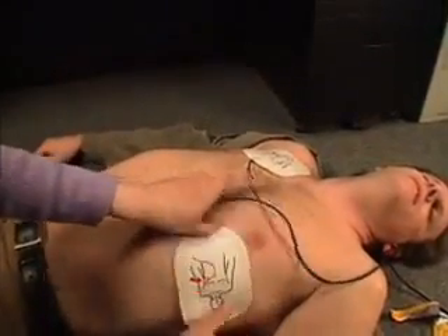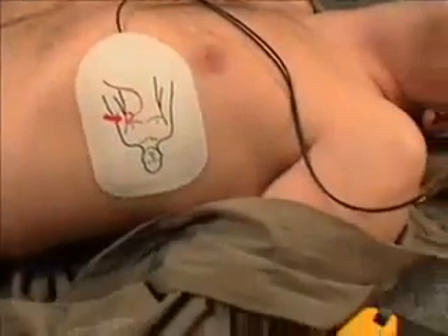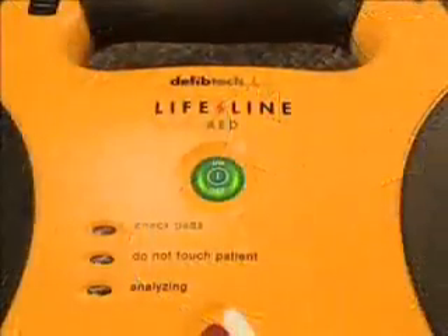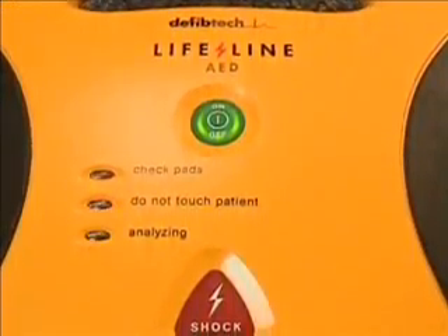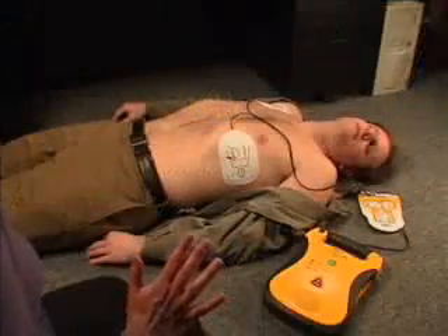Apply pads. Analyzing heart rhythm. Do not touch the patient. The Lifeline AED will automatically check the pad connection to the victim and will begin to analyze the victim's heart rhythm. If the AED determines that the victim requires a shock, the unit will automatically charge and will prepare to deliver a shock. During this time, do not touch the victim.